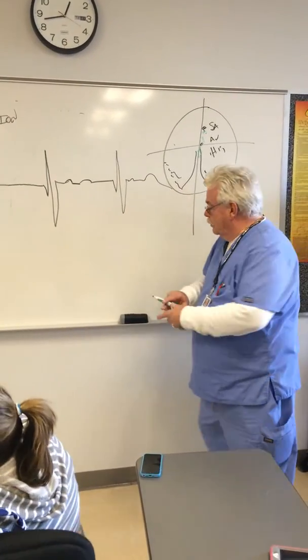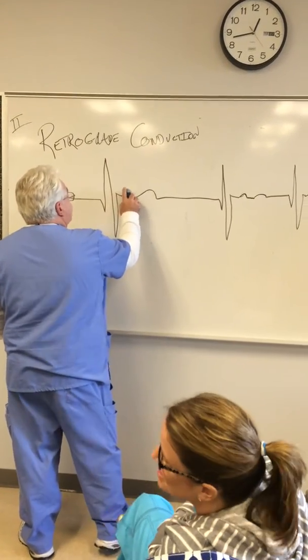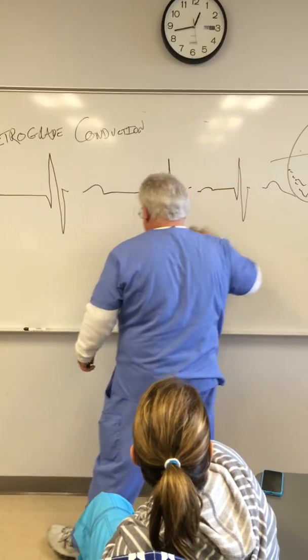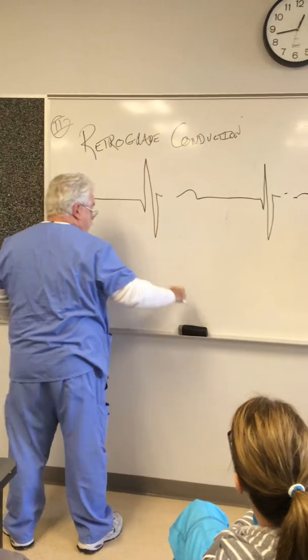Let me screw this up a little more. It's out of order, a messed up alphabet. Remember we talked about lead 2? We're always in lead 2. That's the tattoo and everything's upright.